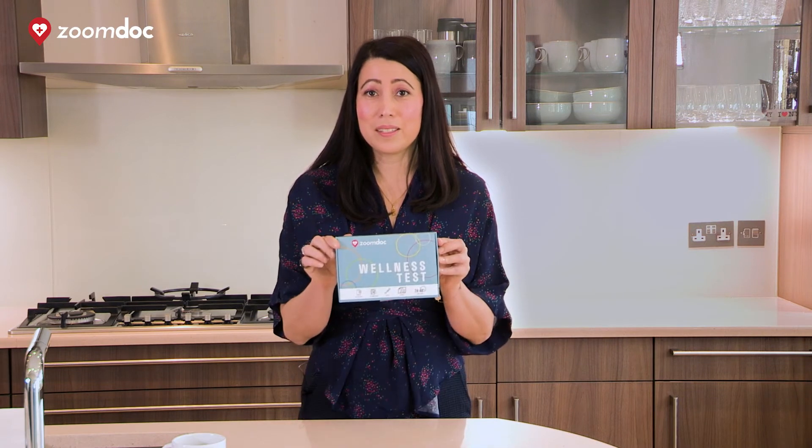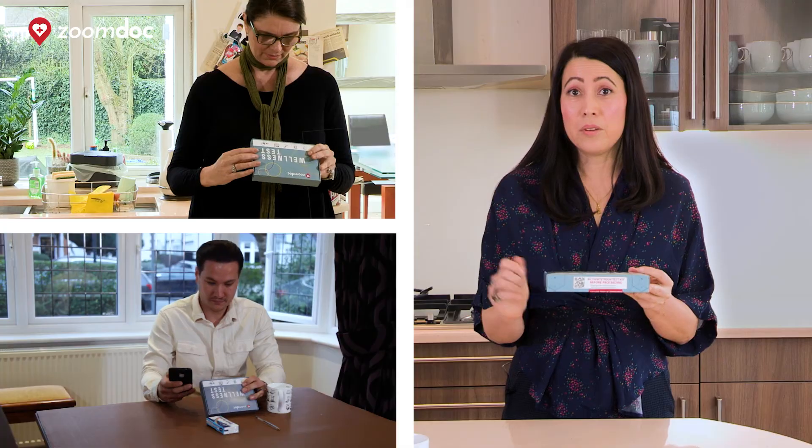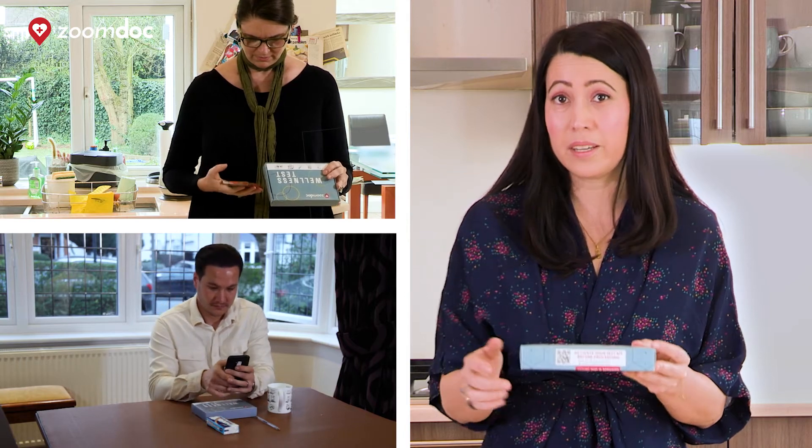Please watch this video to the end so that you can understand how to take your test. When you receive your test kit it looks like this and on the side is an activation code. You can scan the QR code with your phone or type in the website that's on the sticker. If you do not activate the test kit then we will be unable to provide you with the results.